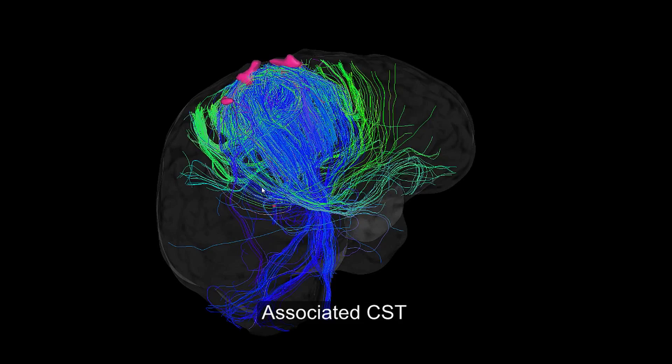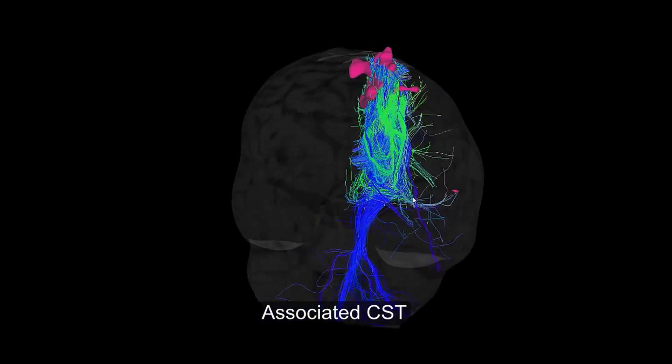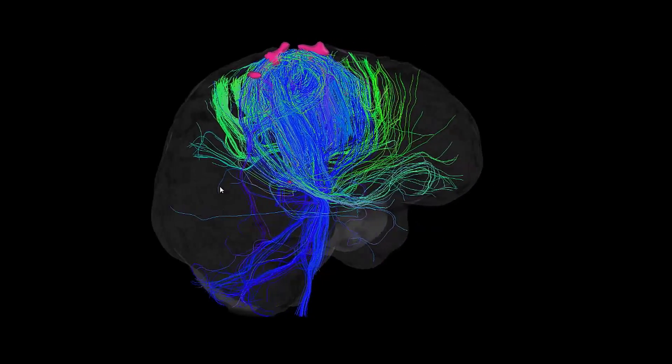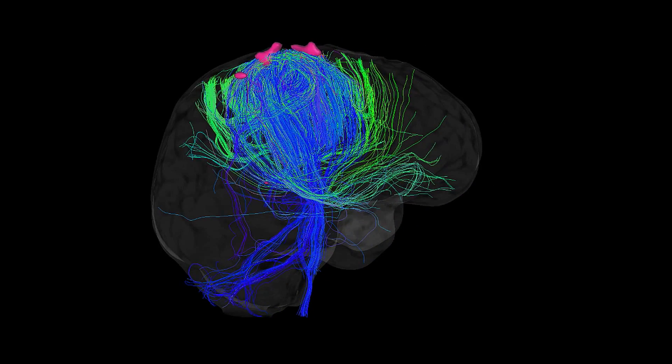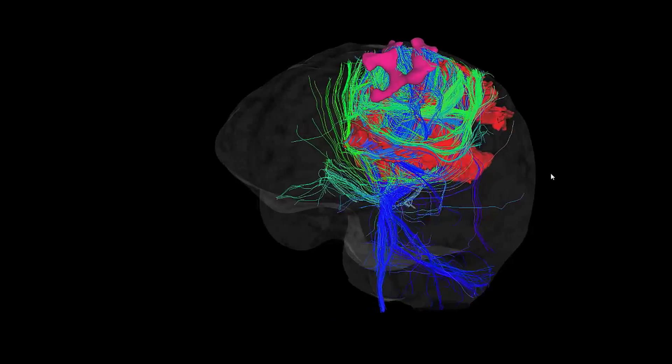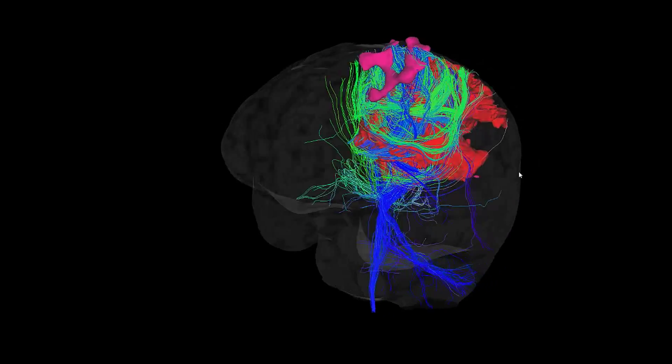The fMRI was done prior to surgery. You see the corticospinal tract — this blue fiber tract — connecting the spinal cord to this foot area, also indicating that this function is still preserved in this patient. So the surgeon really has to make sure not to remove this part of the tumor.